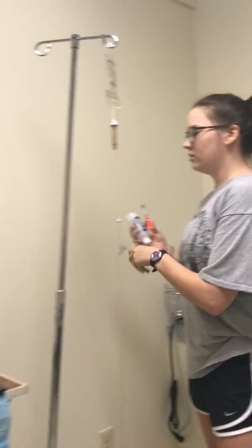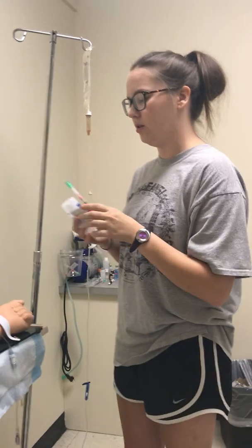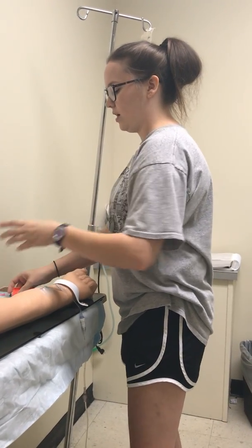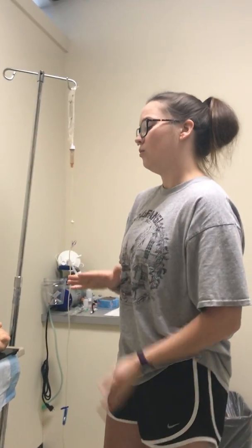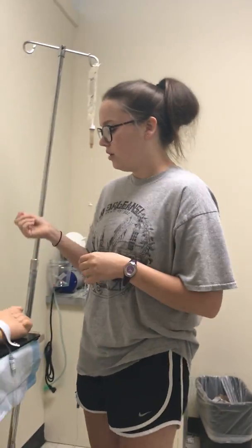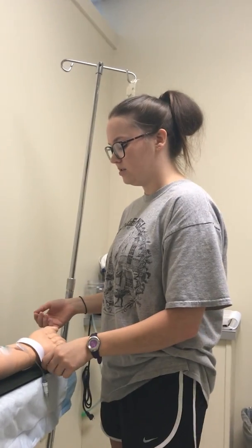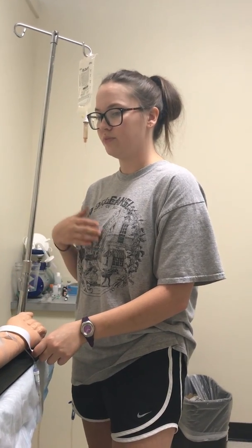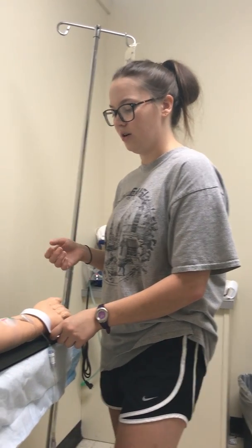I would knock on the door, introduce myself. Hello, my name is Kennedy. I'll be your nurse today. I'm going to be giving you an IV push of morphine in order to help control your pain. With this, you may experience some lightheadedness or dizziness or sweating. I would tell him if he experiences any of these side effects to just let us know.